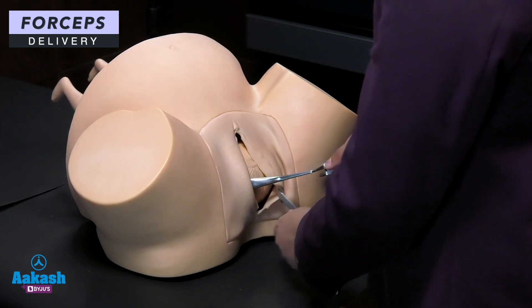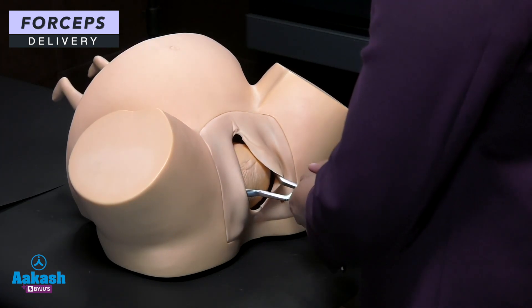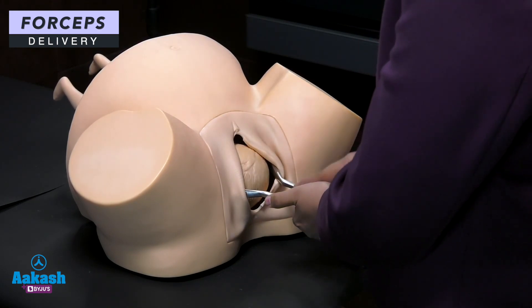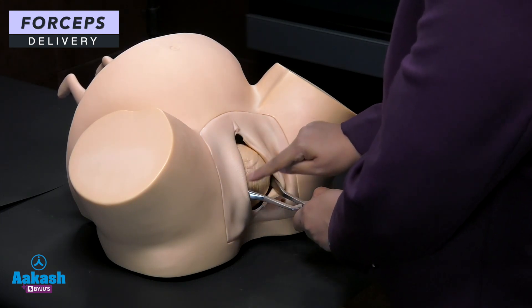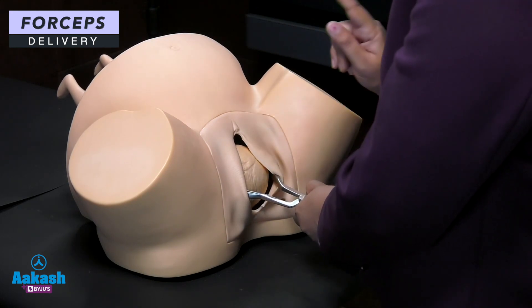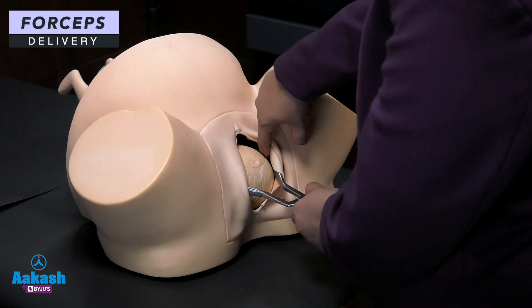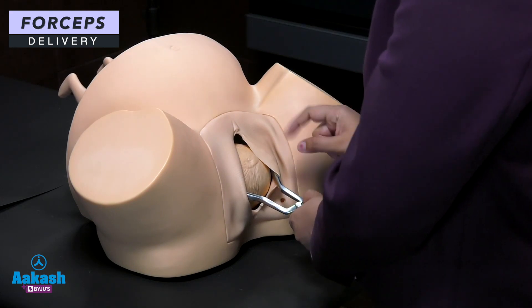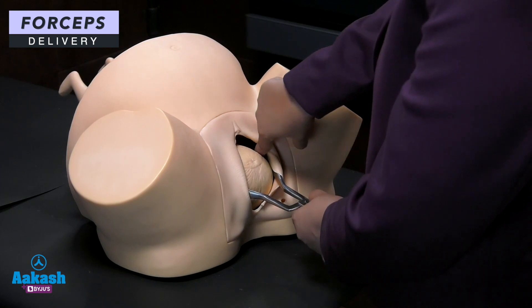Now both blades are inside. If they are nicely placed, they should lock smoothly. The safety features to check: the blades should lock easily; the sagittal suture should be at the center; the blades should be equidistant from the posterior fontanelle; and one finger should easily pass between the baby's head and the fenestration to ensure no undue pressure is placed on the baby's head.